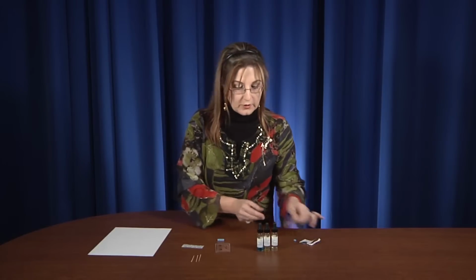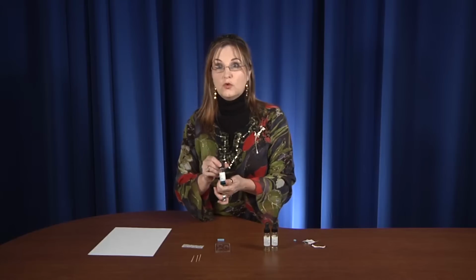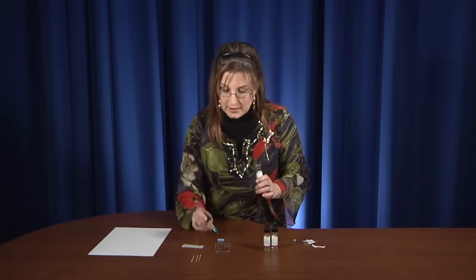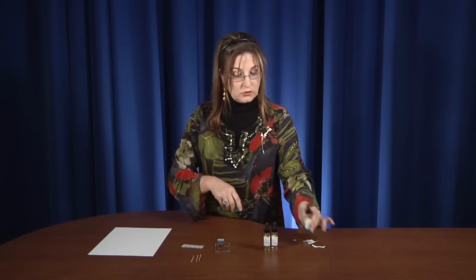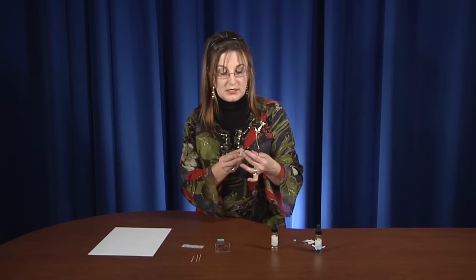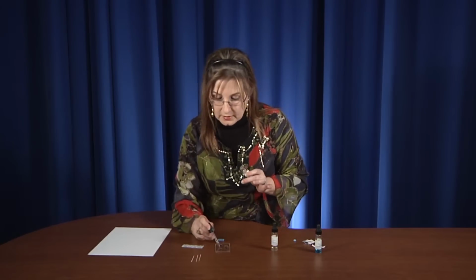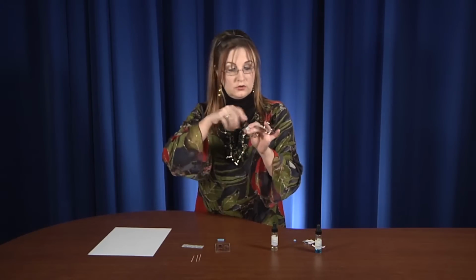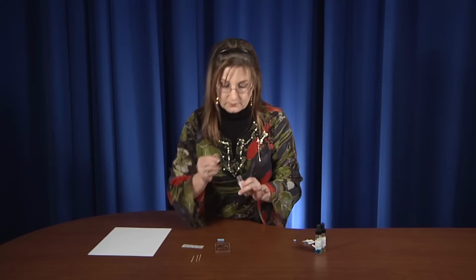All right, all's well. Now, I've done this many times, but I always check my labels before I put these into the wells. So, anti-A goes into the A well. I'm going to put a couple of drops in there so that you can see it well. You may not need that much when you actually do the demonstration. Checking again, anti-B goes into the B well. And be careful not to touch your serum droppers to the blood that's in the well. You don't want to contaminate it. The anti-RH goes into the RH well.